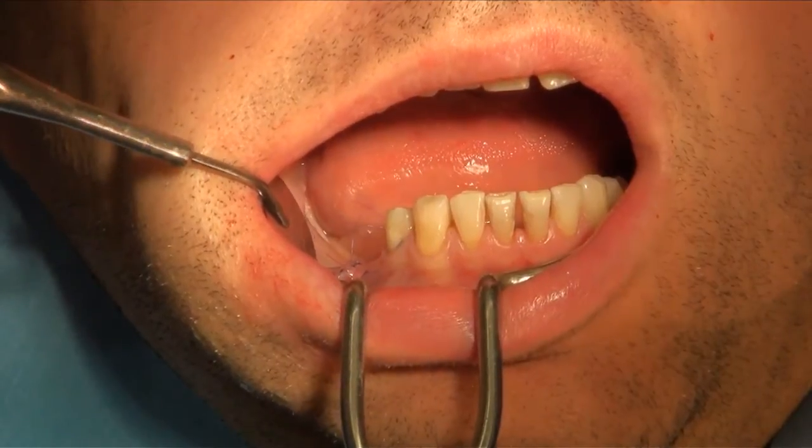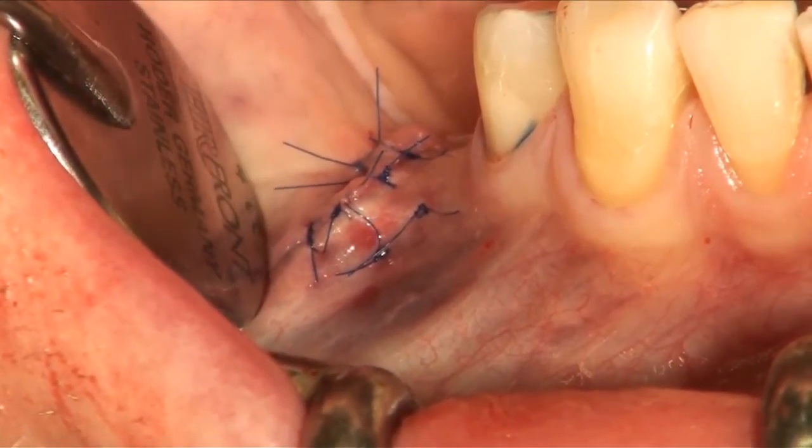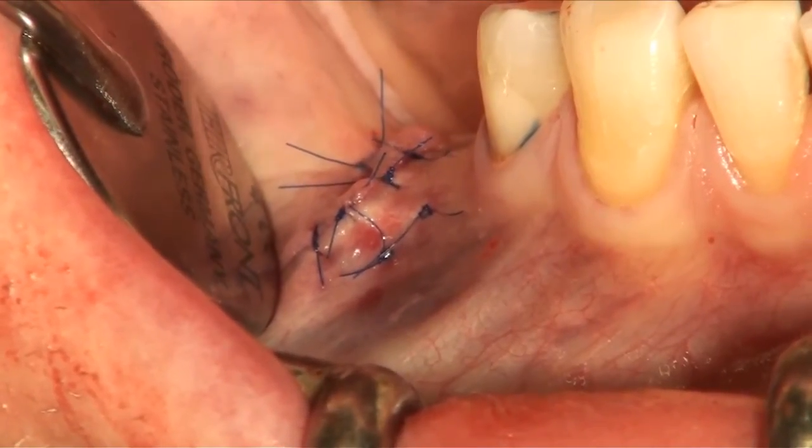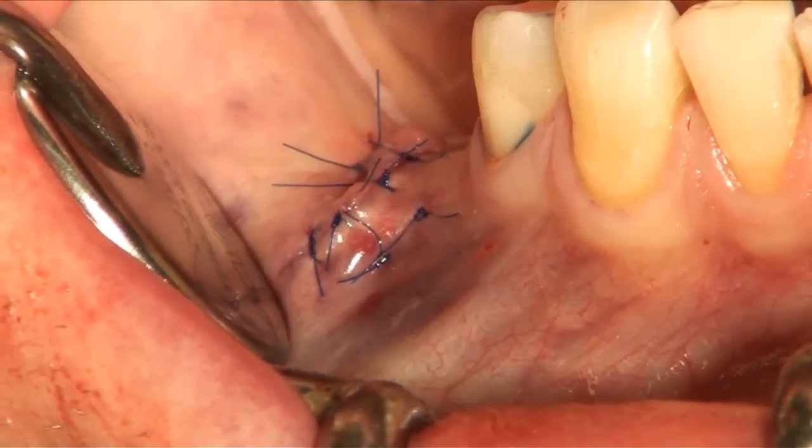This is the end of the procedure. We have a tight two-layered suturing, and the expansion of the expander starts now. After 4 to 6 weeks of expansion, we will do our block graft surgery.